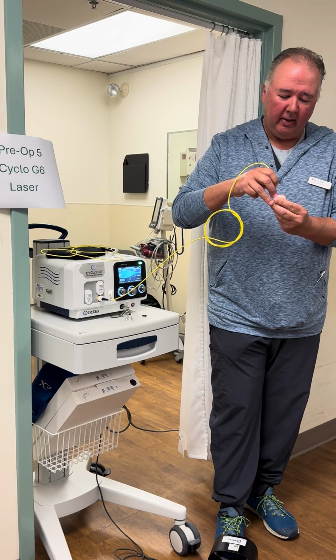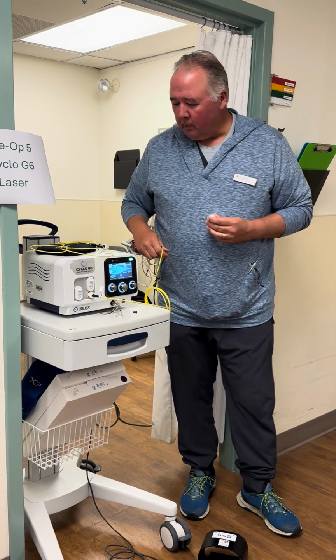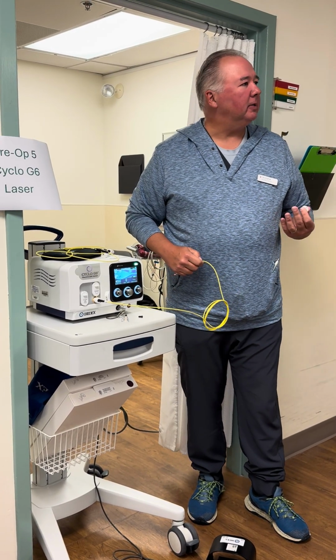That's 2 spots. And then they just go one right next to each other. And the total time of all these treatments is less than 5 minutes.